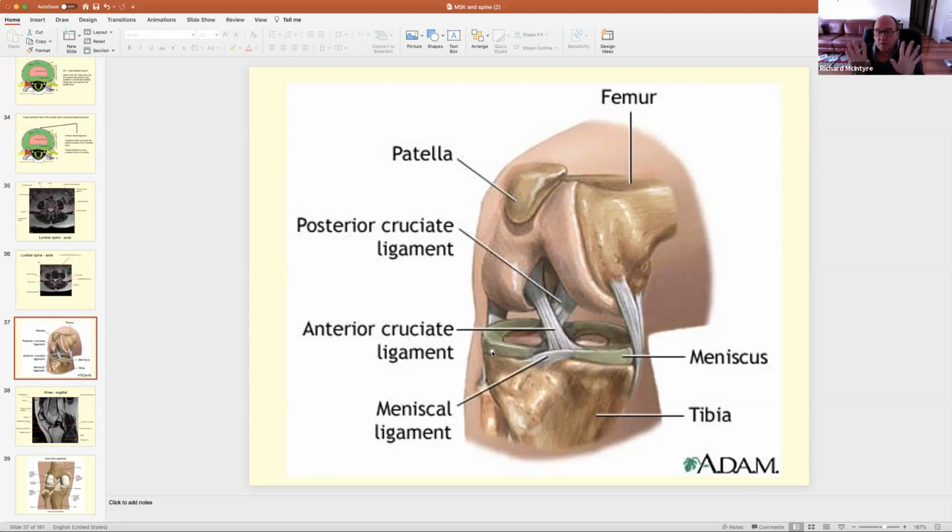So we have two basic sets of protocols in MRI. One set of protocols is for the mechanical damage, which is basically looking at the structures that you can see there. And the other set of protocols that we use is tumour and infection protocols. Of course, we do a different set of sequences that looks at tumour and infection processes in and around the joints and the rest of the body. But we differentiate those two protocols.